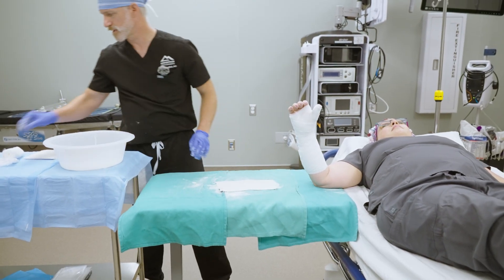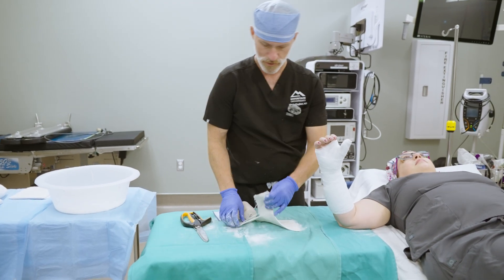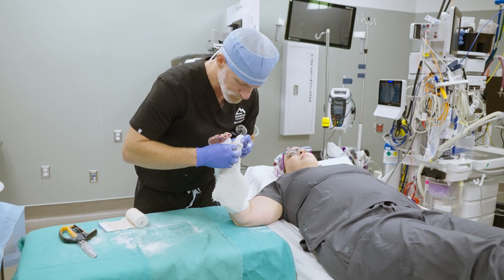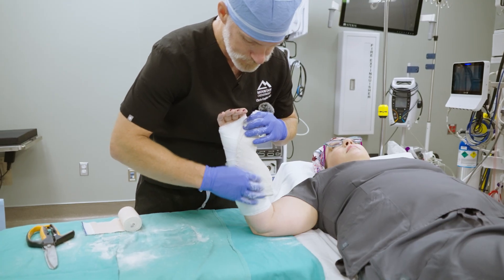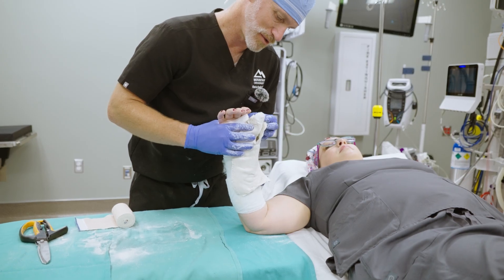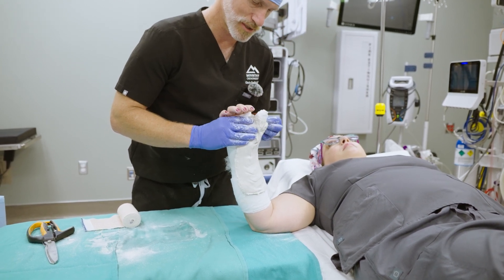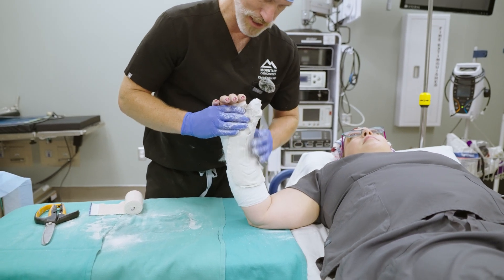We got those nice and smoothed out. The plaster is really moldable, so you can fold these over to fit the shape of the thumb. This one I'm going to put on the palm side, coming down and folding that back, and this one I'm going to bring up the back, folding just a little bit over at the end so it has a smooth surface. I like to make sure these aren't touching in the thumb area — leave some space between them because I don't want them to stick together and potentially get too tight if it swells.